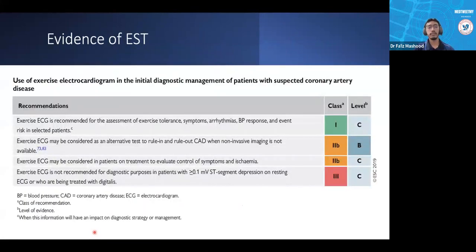So, evidence of EST based on our ESC guideline. The only class 1 evidence is this one. EST is recommended on top of evaluation of CAD for assessment of exercise tolerance, to assess symptoms, to check for arrhythmia, as certain arrhythmia can be unmasked during EST, to check for BP response, and to evaluate event risk in selected patients. I'd like to emphasize again and again, we can consider EST as a bridge to our next non-invasive imaging test.